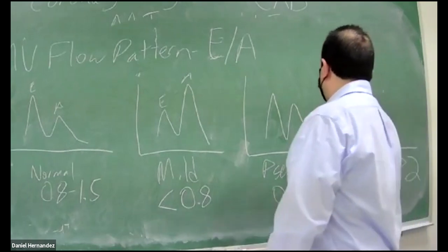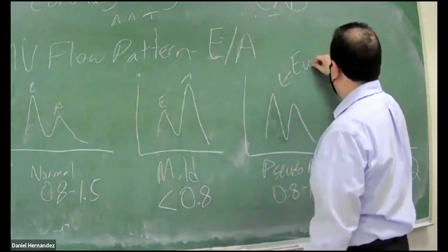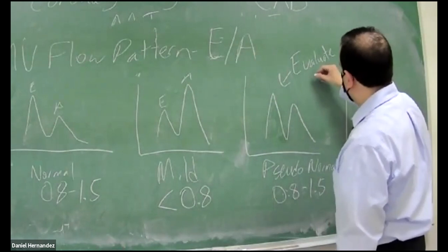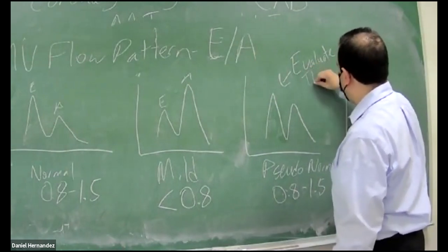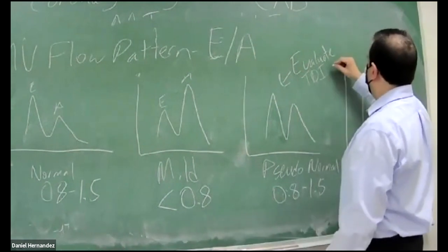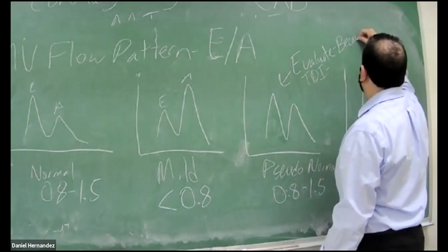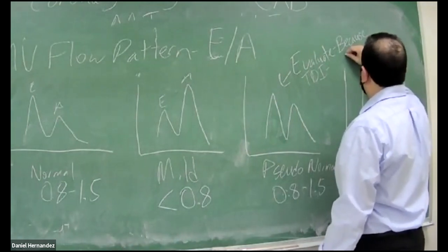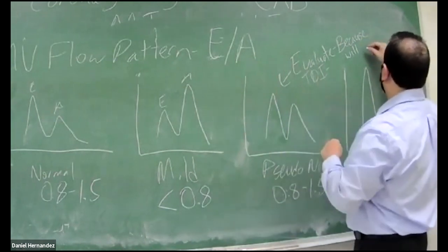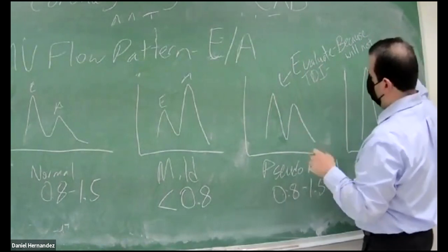But with this one, we have to evaluate our tissue Doppler, because tissue Doppler, I guess, won't invert.